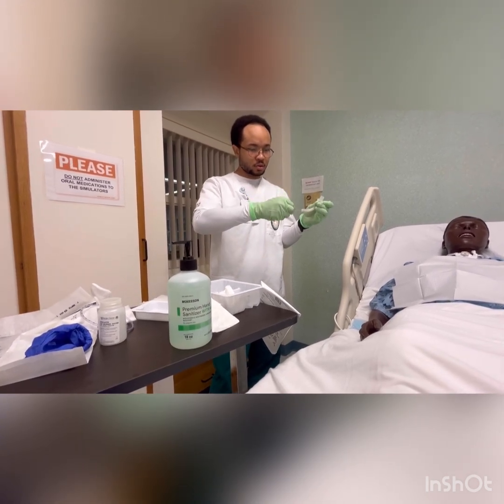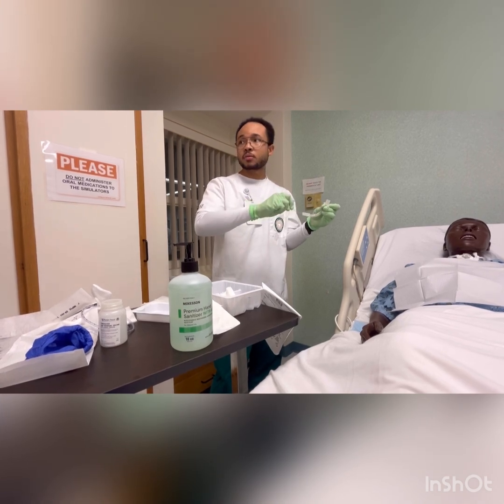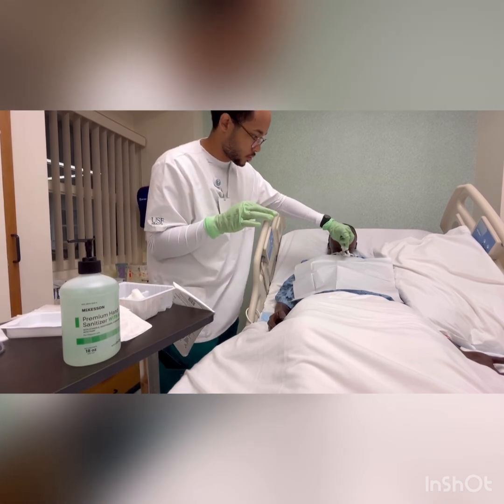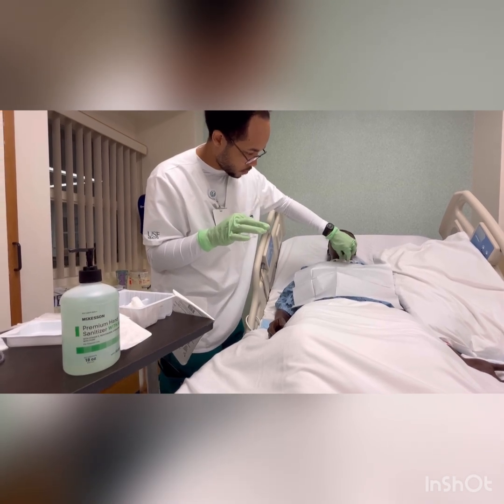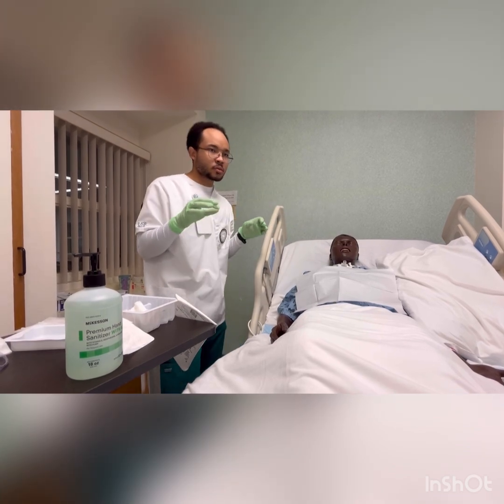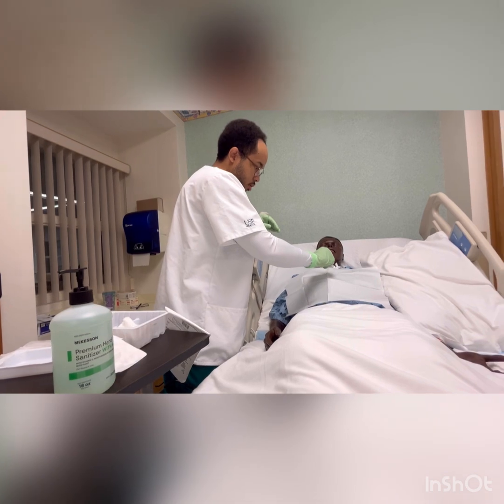You also want to make sure to give ample time for the inner cannula to air dry before inserting it back into the tube. Once it has completely air dried, insert a new or cleaned and dry inner cannula. We want to clean the tracheostomy site, including the face plate, the outer cannula, and surrounding areas.